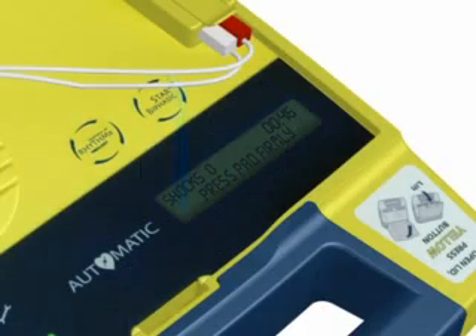Firmly place the pad without the liner on the patient, exactly as illustrated. This pad can be placed on either of the two locations shown.